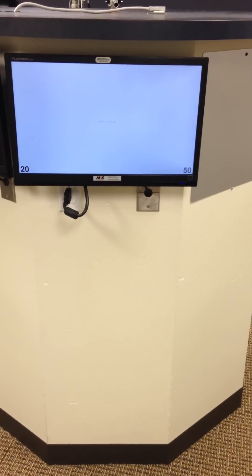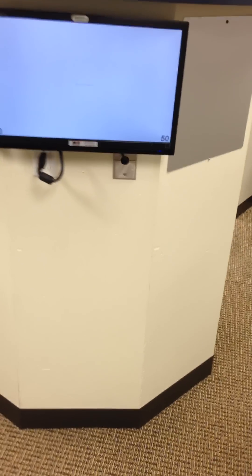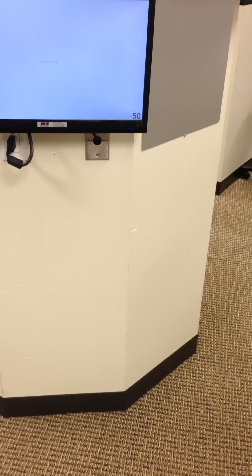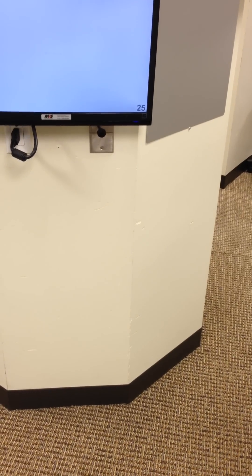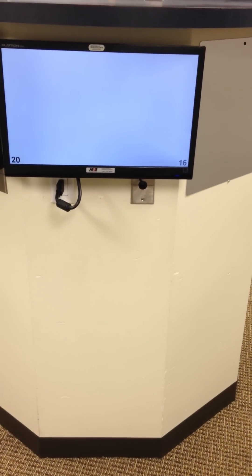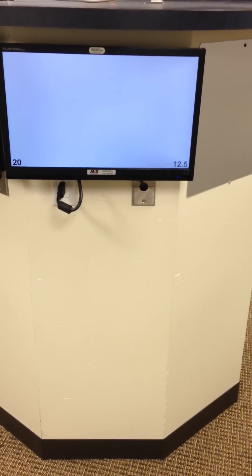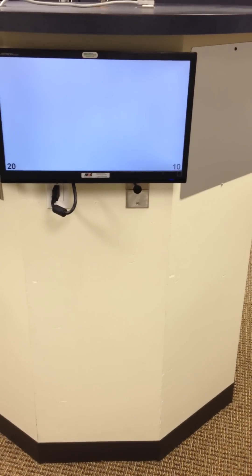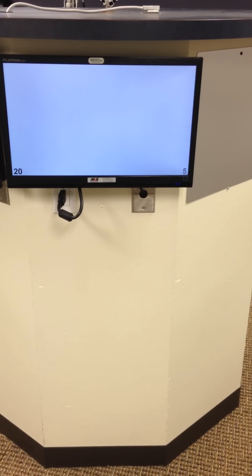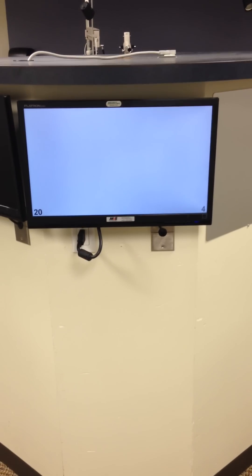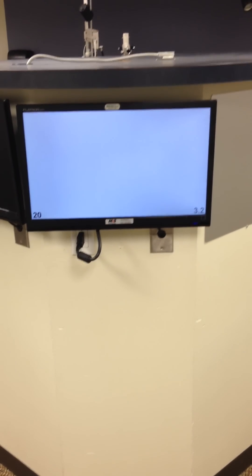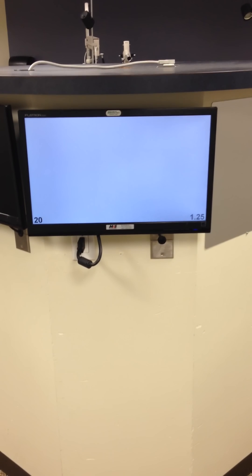And if I hit the other button on the remote, this one, it will change the contrast itself. And you can see it goes down quite a ways. That's a question we had for lab as well. How far can you go? And if you eventually go down all the way, it should wrap around and very hard to see. We generally do single letter on this until we reach threshold.